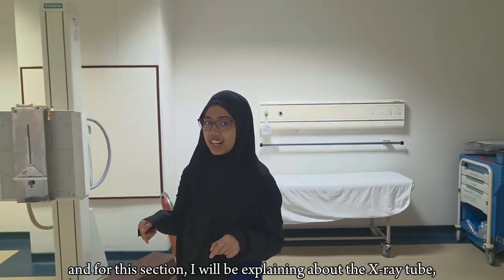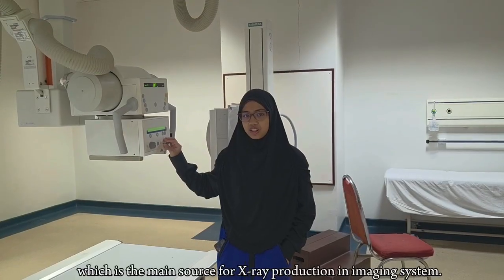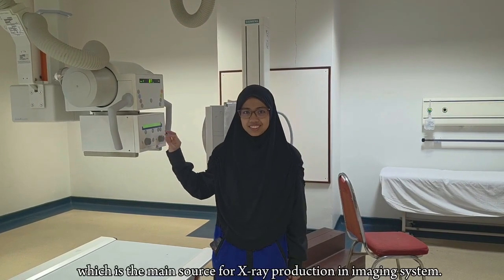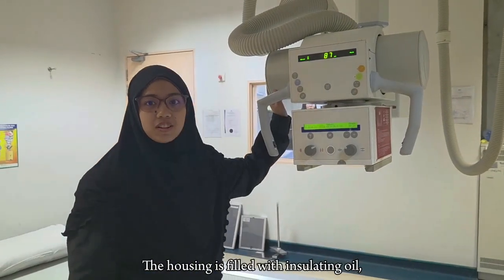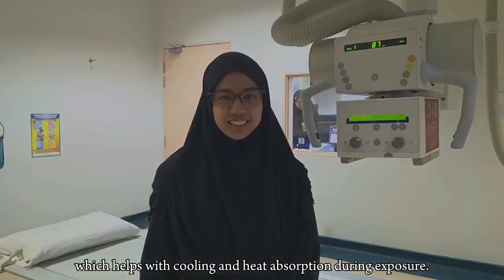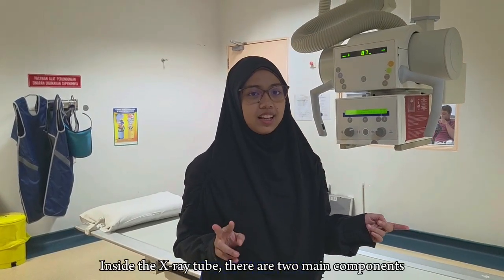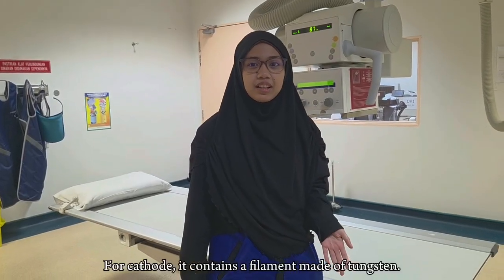Assalamualaikum and hi everyone. For this session I will be explaining about the X-ray tube, which is the main source for X-ray production in the imaging system. This component is known as the X-ray tube housing. Its main function is to protect the internal components, reduce radiation leakage, and provide electrical insulation. The housing is filled with insulation oil, which helps with cooling and heat absorption during exposure. In the X-ray tube, there are two main components, that is the cathode and the anode. For the cathode, it contains a filament made of tungsten.